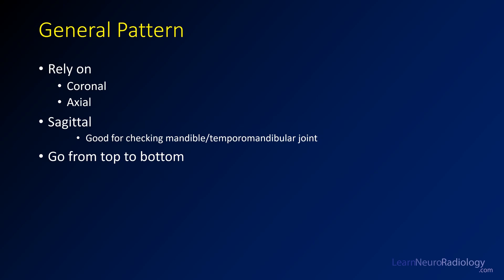When looking at CTs of the face, you really want to rely on your reconstructions, particularly the coronal. The coronal is a key part of your exam. The axial is a nice addition. The sagittal you don't have to use too much, but it's nice for checking the mandible, the TMJ, and the upper cervical spine. As a general rule, try to go from the top to the bottom of the exam.